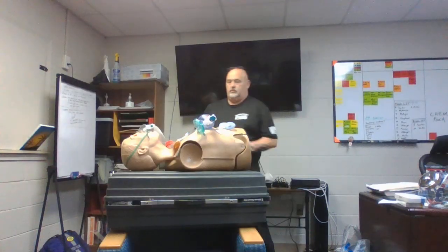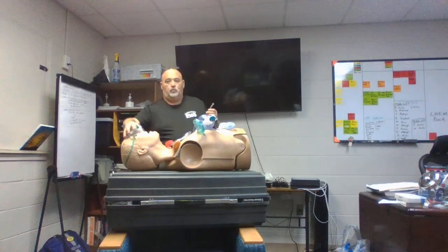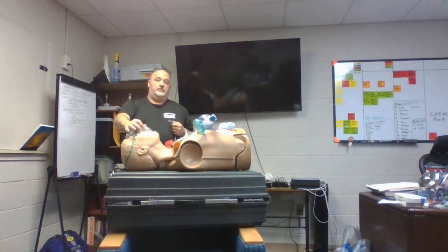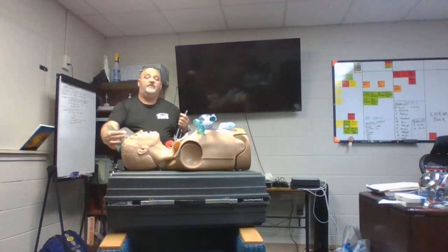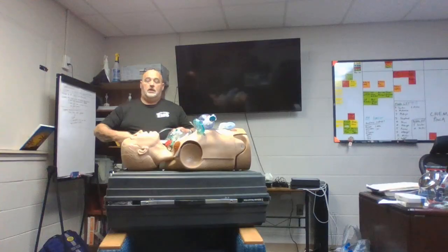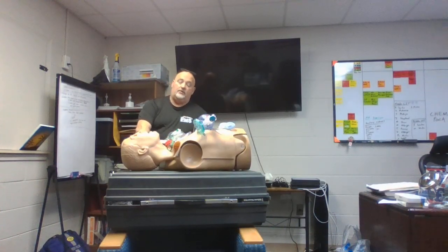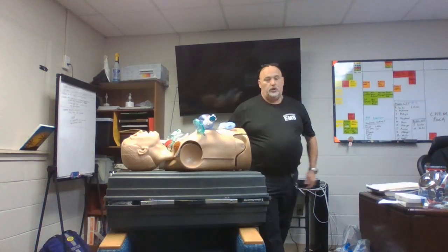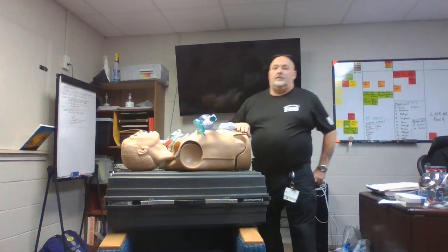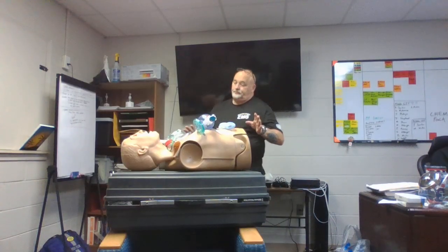So we're going to pop this off of one tank. If you pop this off, take this off. Because why? What are they breathing in now? Their exhaled air. Take it off. Is it bad? I think so. A lot of folks will tell you no. I think it's bad. I do not recommend it. You walk in a hospital with a patient on a non-rebreather that you've unhooked to move in, and the ED staff is probably going to have a stroke if they haven't already. So, do not recommend.